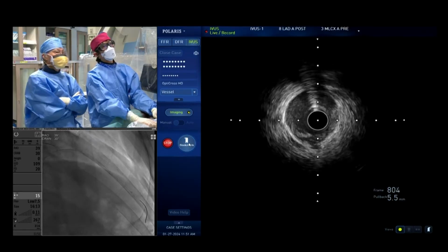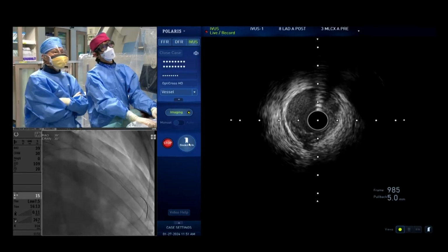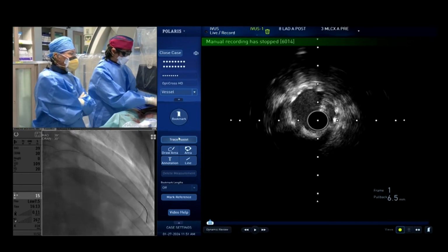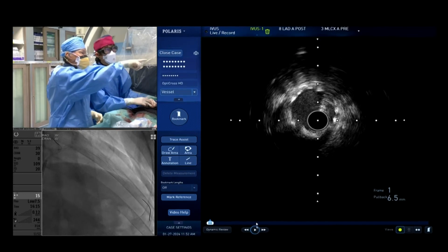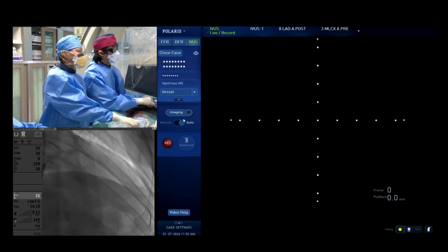Right. Definitely, the stent was landing in plaque, at 8 to 9 o'clock it's suspicious, but it's not flow limiting. I think it's not. What about the rest of you? On the 9, because IVUS resolution is always less than the OCT, the stent could have landed in the area that has some plaque, but I don't think it looks very significant.